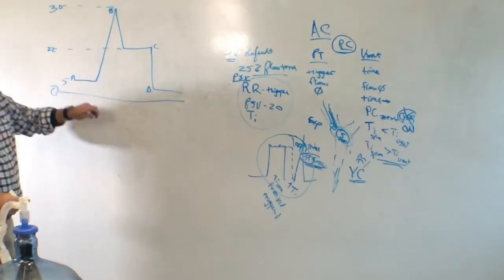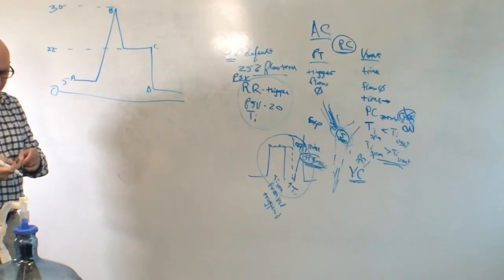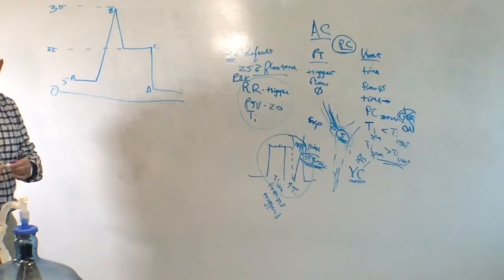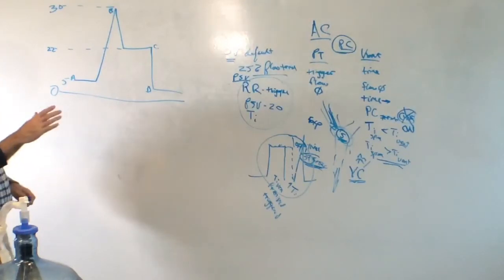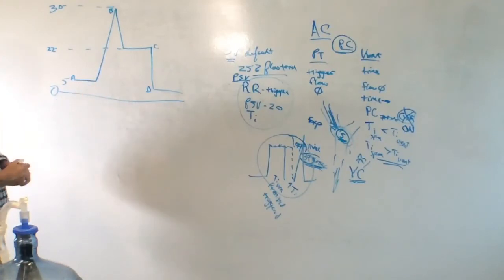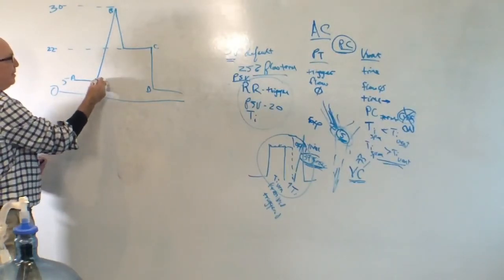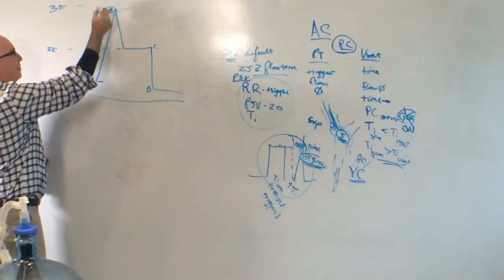For most of my career, in fact, I'll admit to this, and if someone says, Mike, you've been out of touch because for the last 25 years people haven't thought of driving pressure this way. Regardless, I'll be completely honest with you. Up until the last 2 years, this is exactly the way I thought of driving pressure. When people spoke of driving pressure, to me it meant the pressure from A to B.